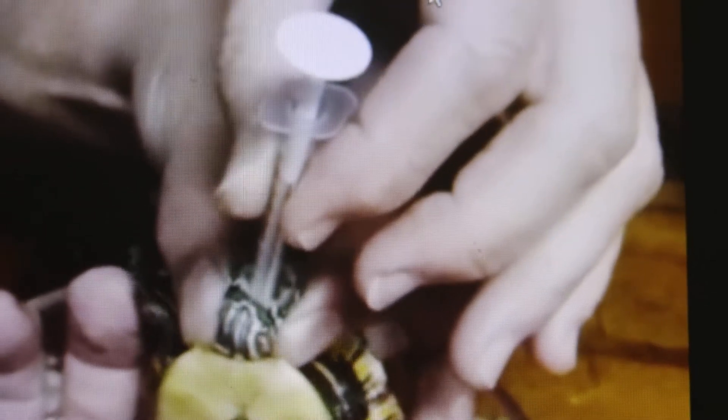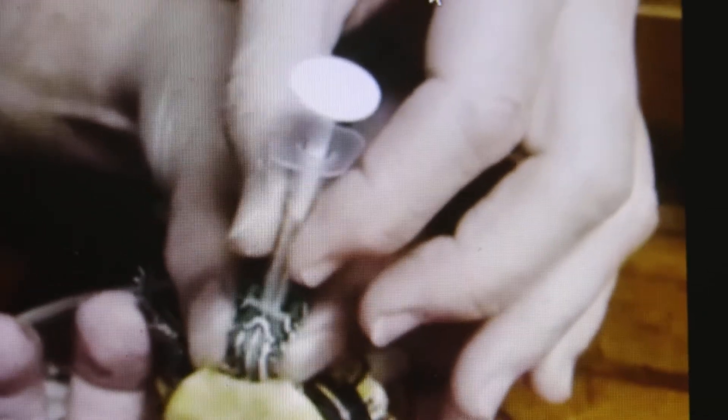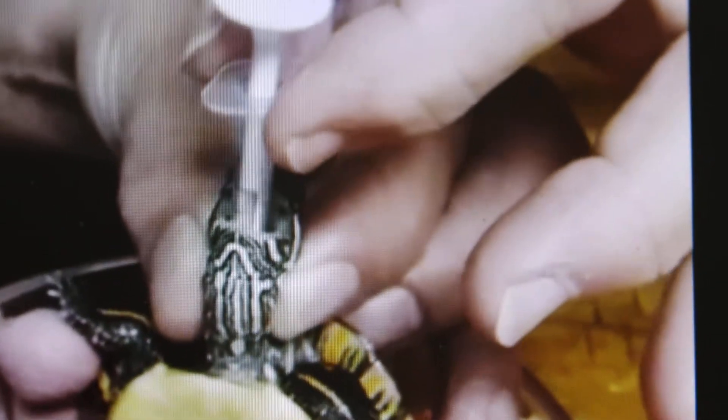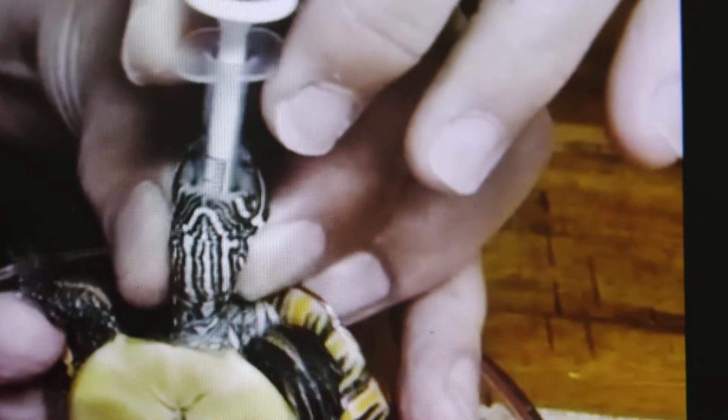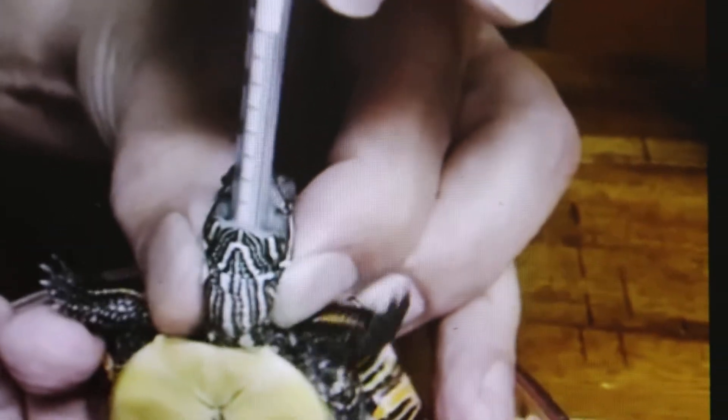Stomach tubing a painted turtle. This video shows how the owner does it. The neck is gripped between the finger and thumb, then the other finger pushes the small syringe with medication into the throat down to the stomach and the medication is pumped in. This is how the owner did this syringe stomach feeding in a painted turtle.